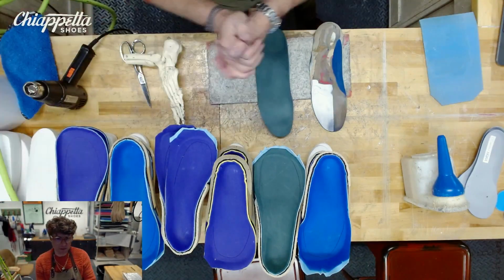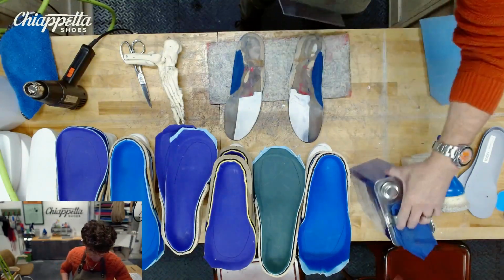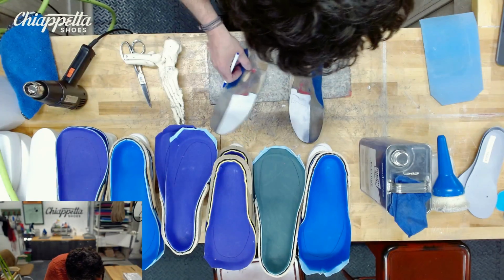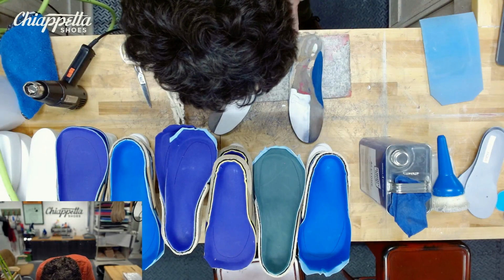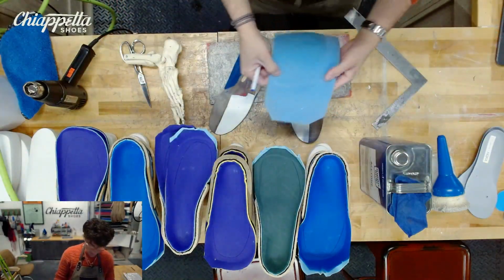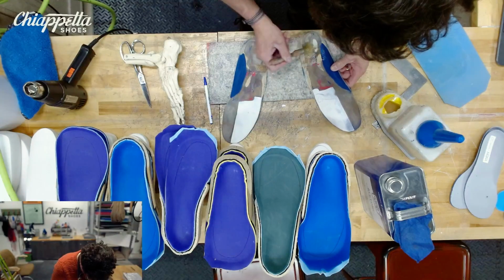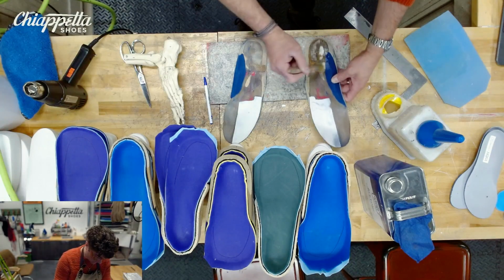All right, Pete, can you throw me the acetone? Rear foot. Thank you, sir. Now, I know I said I wanted to re-level and start fresh, but considering this foot type, sometimes these real high rigid over supinated feet like some extra heel cushion. We're going with 6mm Sport Poron, open cell, spongy material, holds up really well against wear and tear, acts as a great cushioning pad, compresses down to about 50%. We're raising the heel up 1/8 of an inch functionally, okay?